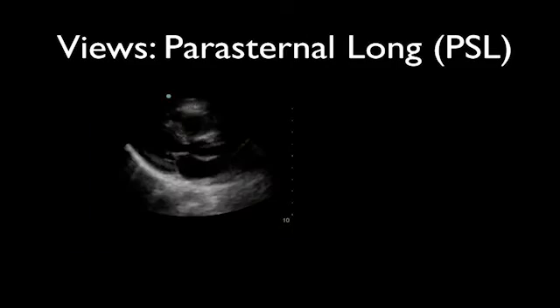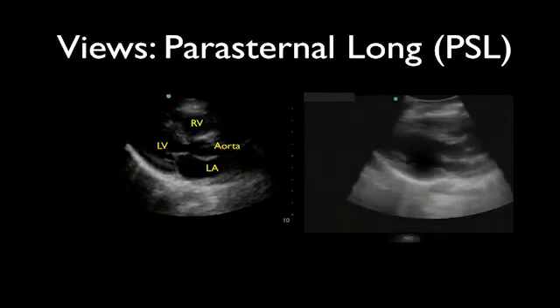Now, do you remember what the most anterior structure was? Right ventricle. Right, so right ventricle is on top. And then in this view, most of what you see is actually the left ventricle. So you see a lot of information. You get a lot of detail of the left ventricle. Then you have the aortic outflow tract stacked and parallel on the left atrium. Now, one structure you never see here is the right atrium. So this is not a 4-chamber view.